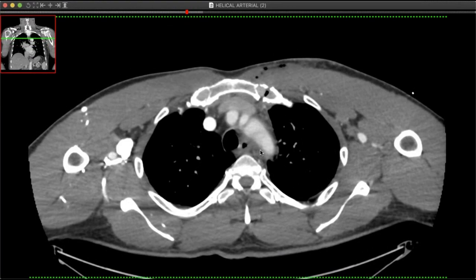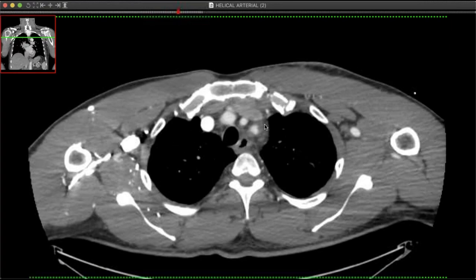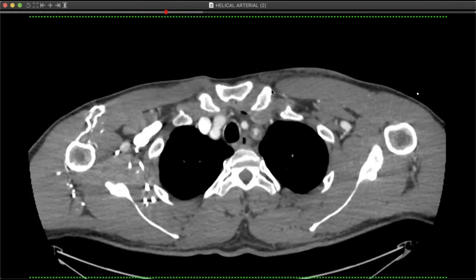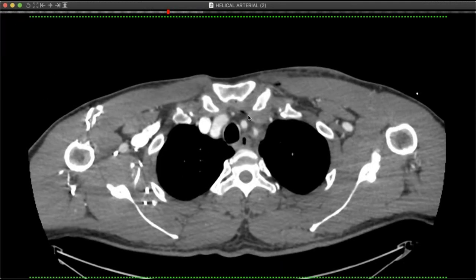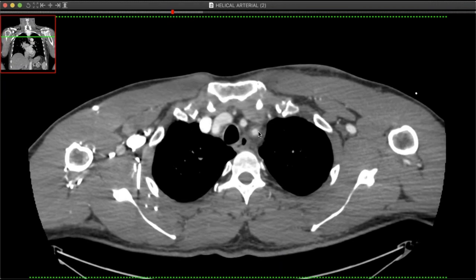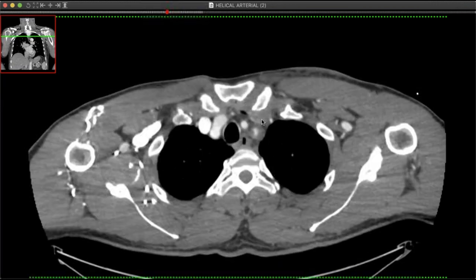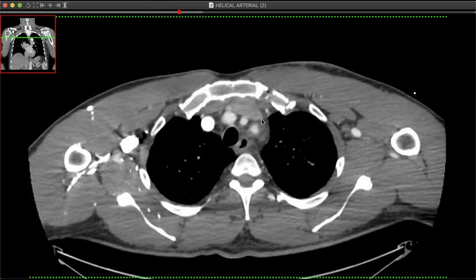But I don't know how it got the subclavian artery. I keep looking at that left sternoclavicular joint and wondering if the clavicle perhaps subluxed. Yeah, you wonder. It is a little wide there, and you see maybe some capsular disruption right here. Yeah, I'm wondering if it just subluxed or transiently dislocated. And I wonder if that's unstable. Yeah, I don't know. Wow.